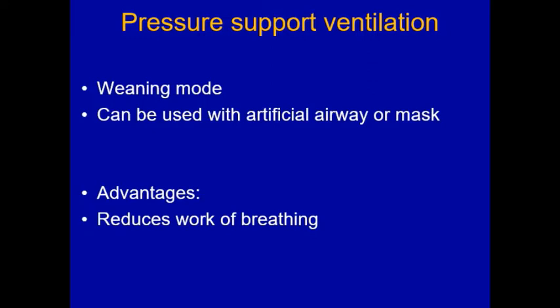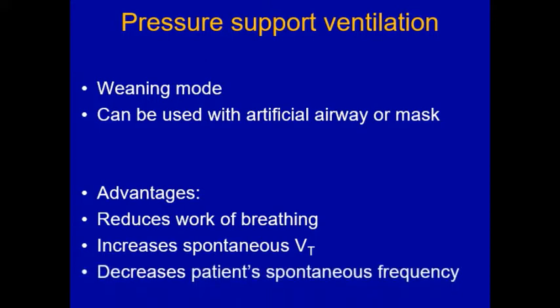Okay. So this is all about the basic modes of mechanical ventilation. That is continuous mandatory ventilation, controlled mode, assist control mode, intermittent mandatory ventilation, then synchronized intermittent mandatory ventilation and pressure support ventilation. In the next part, we shall know about the newer modes of mechanical ventilation. Thank you.